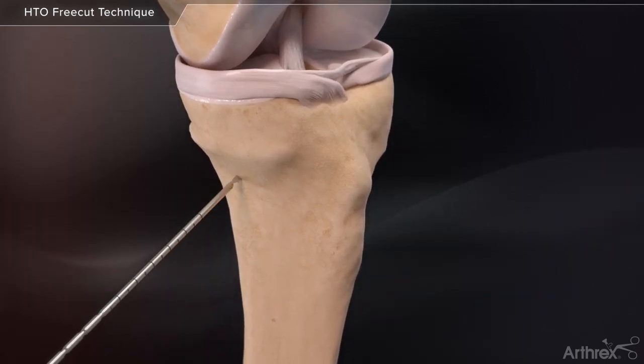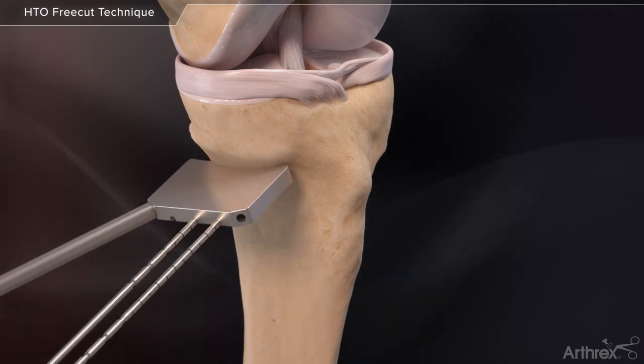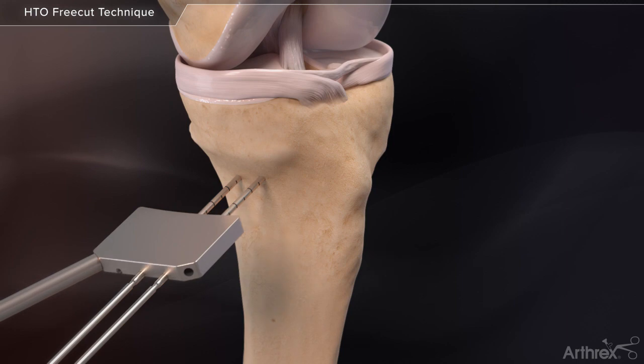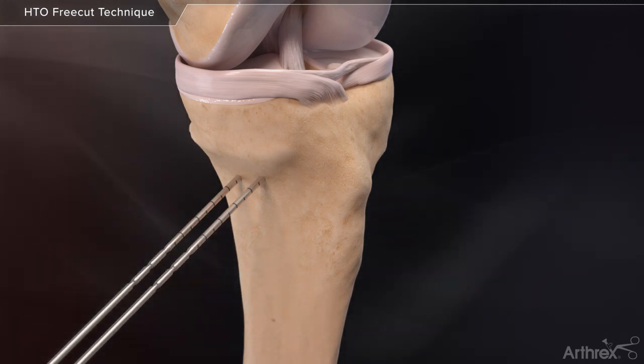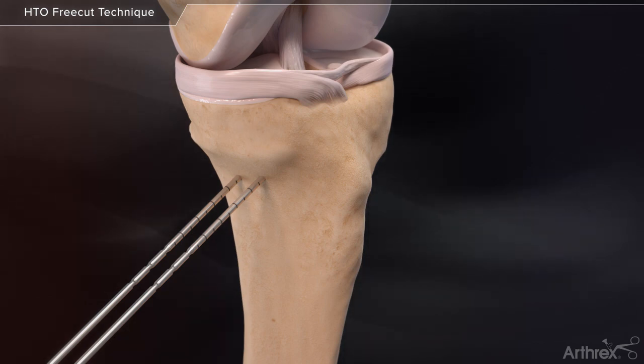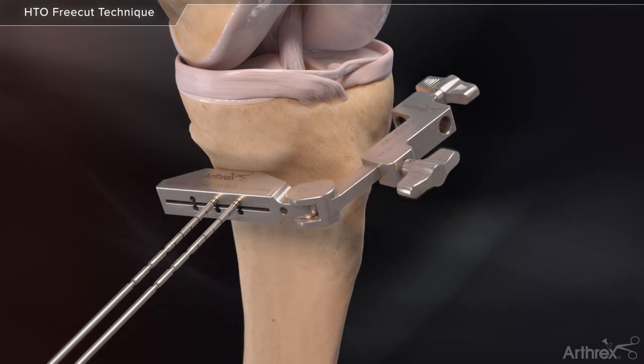Two guide wires can be positioned in the conventional method. Care should be taken to match the native slope of the tibia and to not drive the guide wires all the way to the proposed hinge position. A hinged cutting guide can assist with linking the hinge location to the predefined guide wires. Slide the cutting guide over the guide pins and position the hinge guide appropriately.